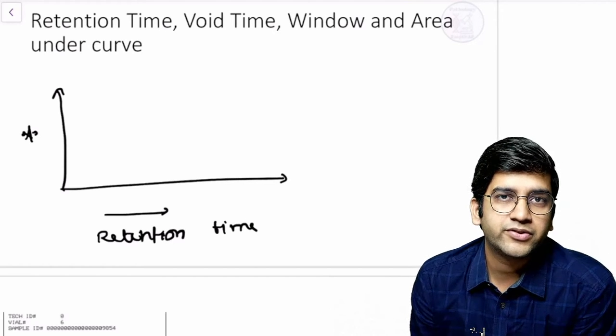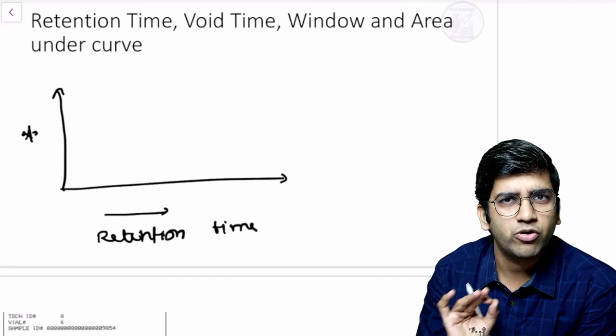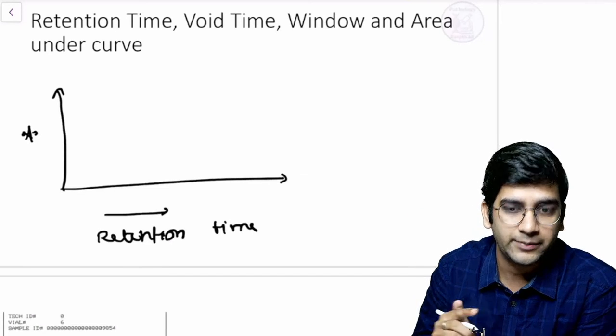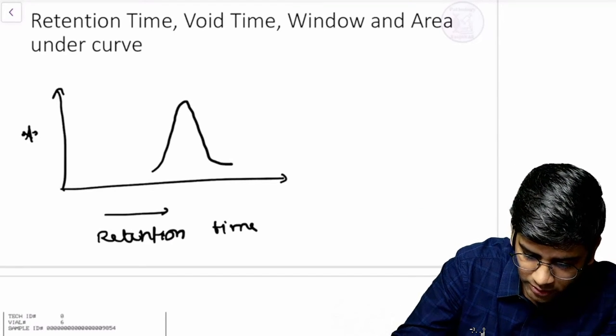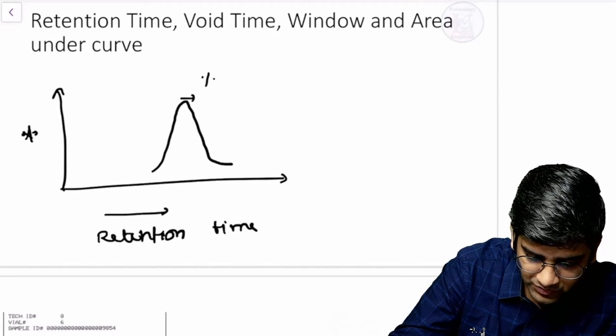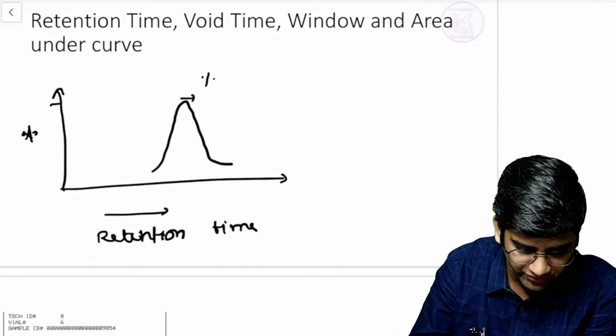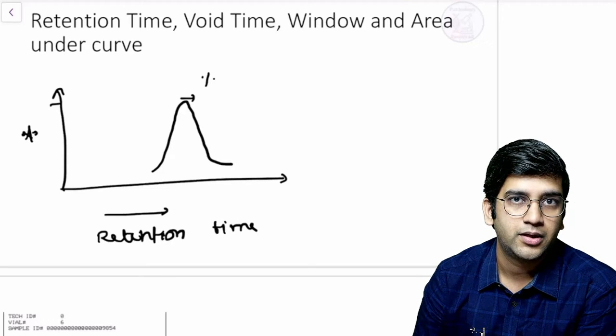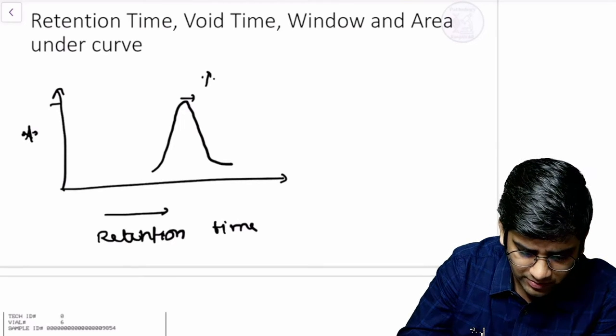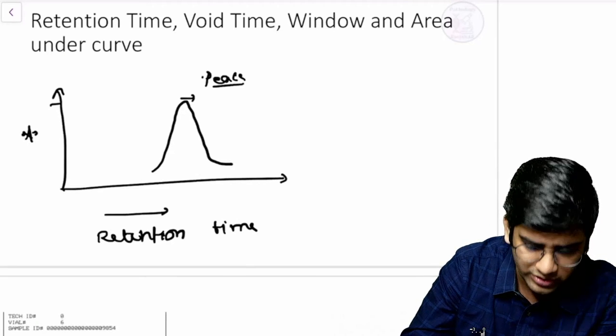So what happens here is, I will have a peak. Let me draw a peak and let's see what these exactly mean. Let's assume I'm having a peak like this. The topmost thing is obviously the percentage. Let's say if it's 50%, that's a peak there, fine? Here, that's just the peak. Ignore it. We'll come to it again.